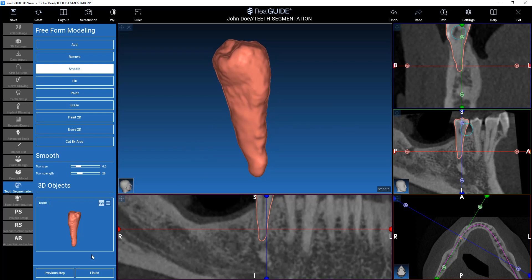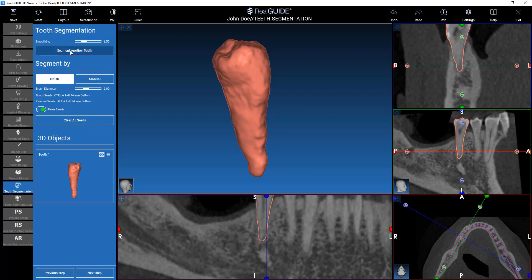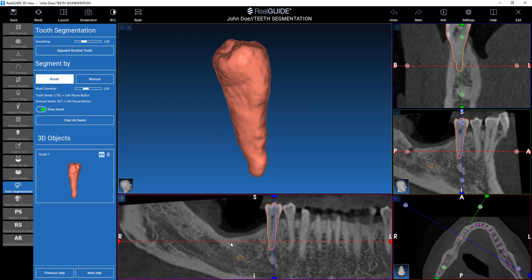If you click on Finish, we finish the segmentation process. If you go to Previous Step, we can click on Segment another tooth and the new command becomes active.